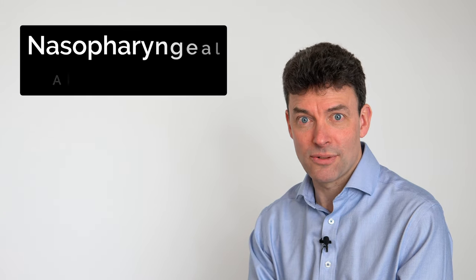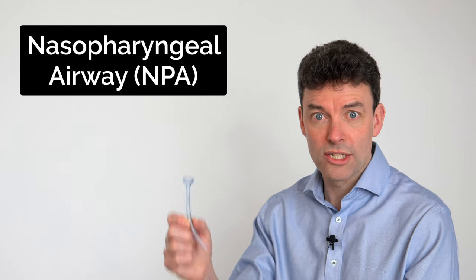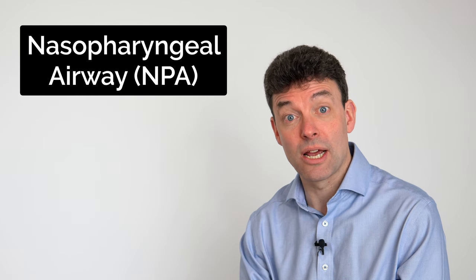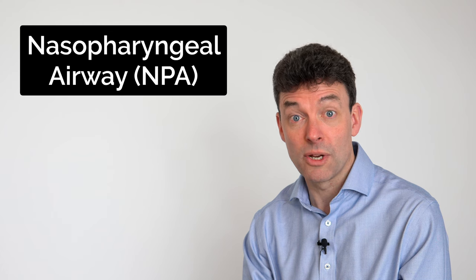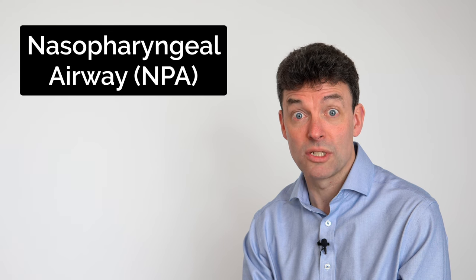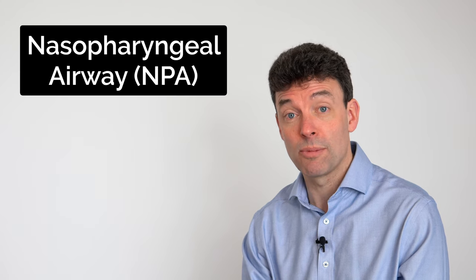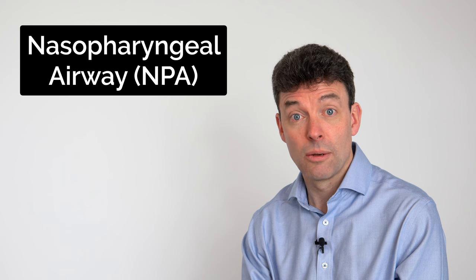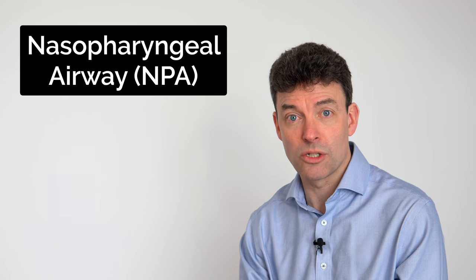Hello, my name is James and today we're going to be talking about the nasopharyngeal airway — that's one of these tubes. It's really essential that you understand how this works because it can be of vital importance if you're managing a patient who has difficulties with their airway. I'm going to explain a bit about it, the indications for using it, and then demonstrate on a model how we put it in.